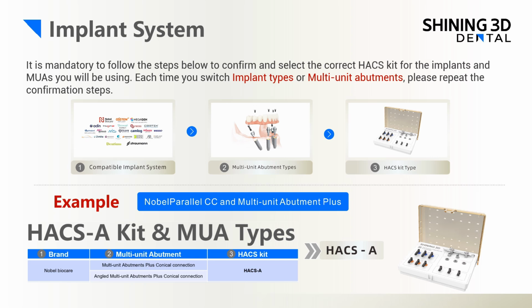For example, in the case below, the implant brand Noble is used as a compatible implant system. The next step is to confirm if the type of multi-unit abutments you're using is on the list on the next page. Once confirmed, it means that the high-accuracy coded scan body type A kit can be mounted and fully seated on the multi-unit abutment for use. If the multi-unit abutment type is not listed in Shining3D's tested types, please contact us for further confirmation to avoid affecting the actual scanning workflow and the patient experience.